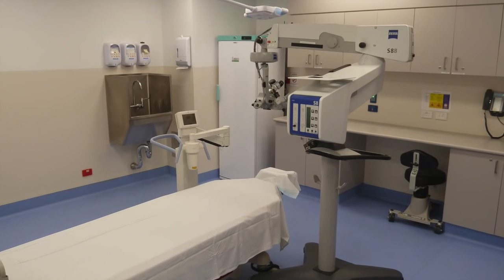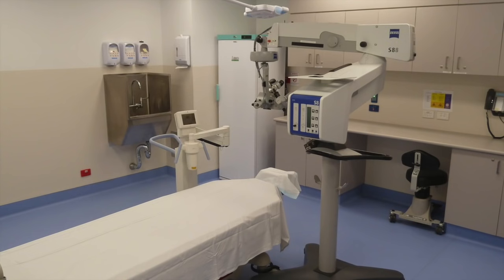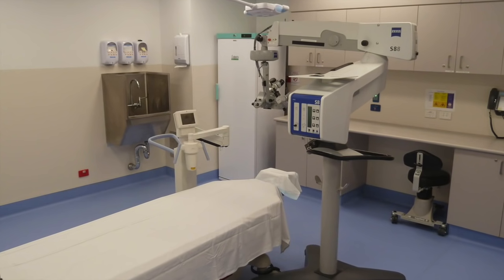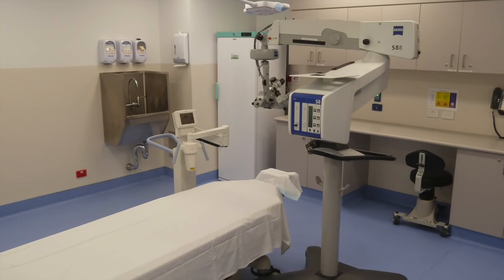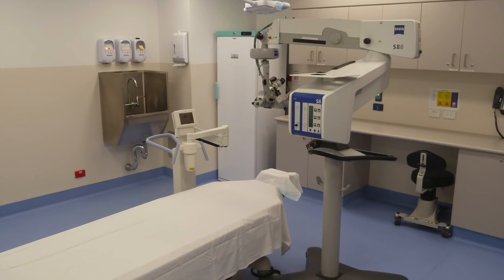We have a dedicated procedure room for crosslinking and other procedures that's decked out with overhead lights, a surgical microscope, a crosslinker, and all of the other equipment we need to make the procedure safe and comfortable for you. There's, of course, music playing so that you can be distracted while the procedure is performed.